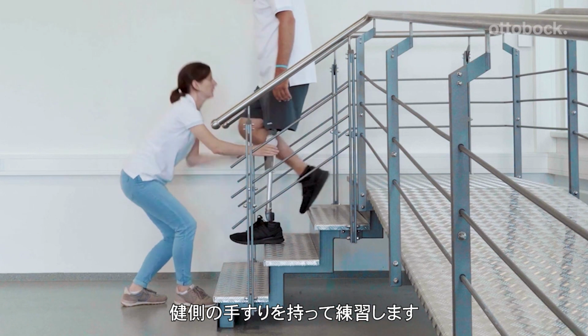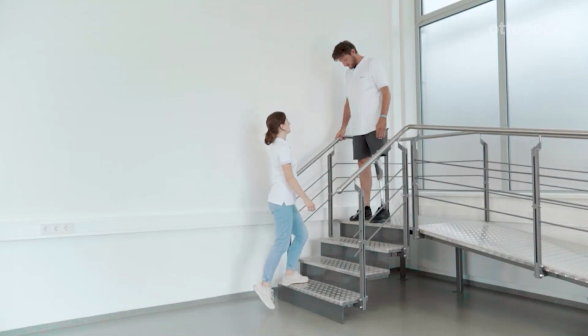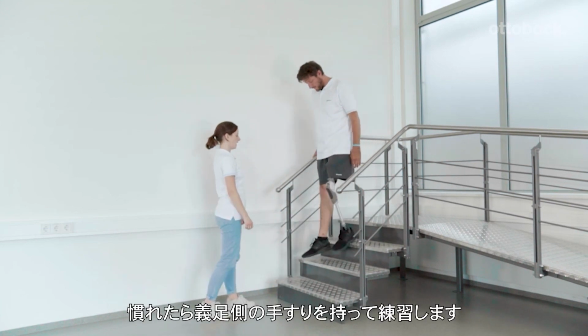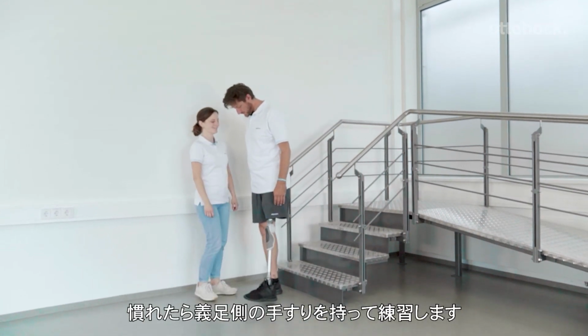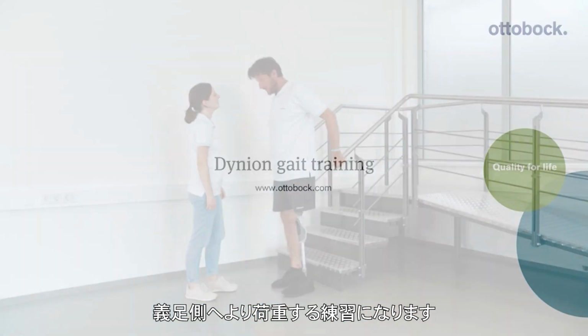Start the training using the contralateral handrail and make sure the upper body stays upright. Use of the ipsilateral handrail increases the intensity of training because the model must load the prosthetic side more.